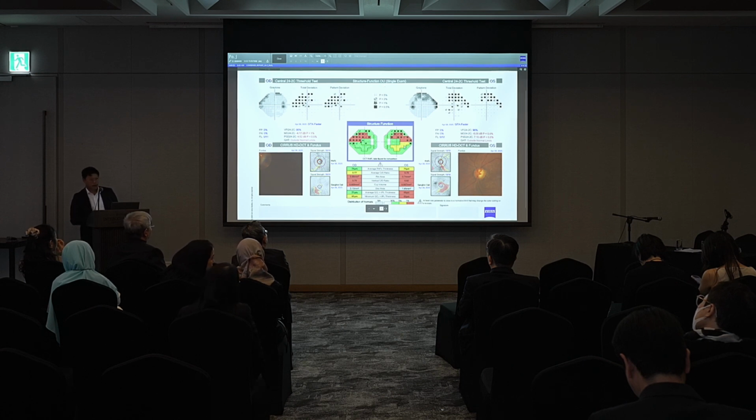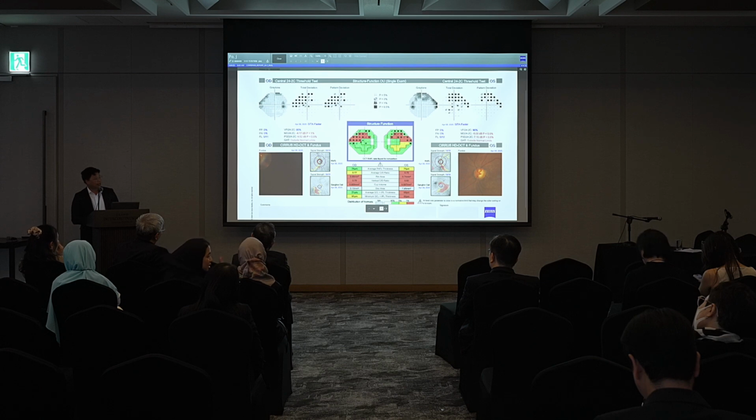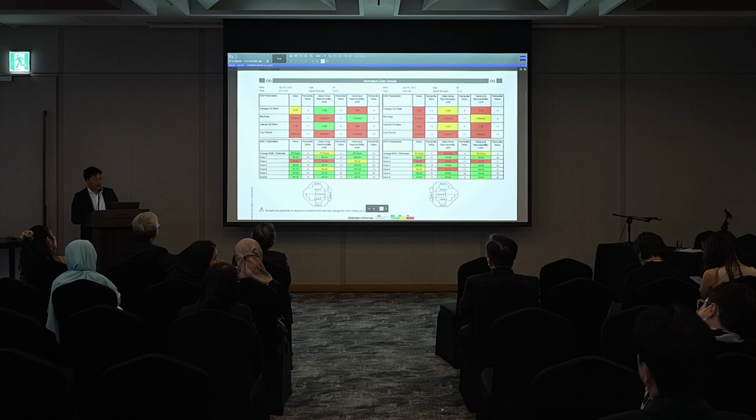And from this one structure function report, it's all here. Like Manchima said, you've got your visual field losses overlaid with your structural OCT analysis just to see if there's a disc field mismatch, and all the important parameters of the optic nerve as well as RNFL and ganglion cell maps. If you're ever really interested, you can actually go to page number 2 that most of us never look at. Basically that will show you all the different zones of the optic nerve in terms of breakdown if you ever want to see top and bottom.